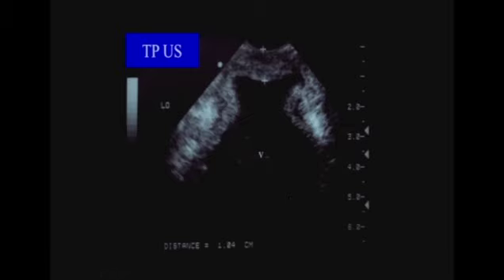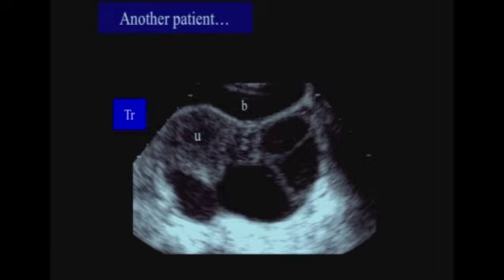This was an exam requested by my surgeon to know exactly how thick the area of obstruction was. So this is a perineal view in which the transducer was placed on the labia, and we're able to see the dilated vagina. We're not going deeper to see whether the uterus is involved or not, but we're able to say that there is a certain thickness, marked off by the double arrow, of the hymen, or whatever the obstructing structure is.